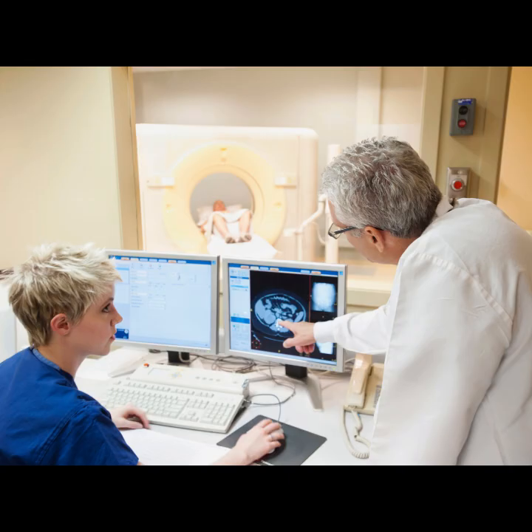Okay, but that reliance on the speed of the FFT, that's really a historical constraint, right? Not a fundamental scientific limit. It reflects the computational power we had back in the 1980s? I agree that today's clinical sites often lag behind the cutting edge, but the technology is moving quickly. We're now seeing real-time reconstruction devices using massive parallel processing hardware, like large arrays of simple, efficient processors, FPGAs, for example.